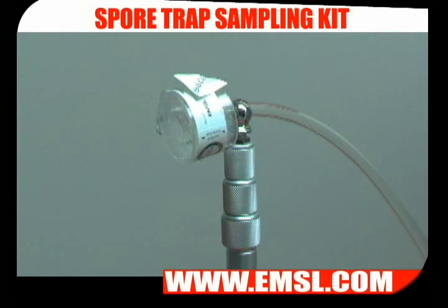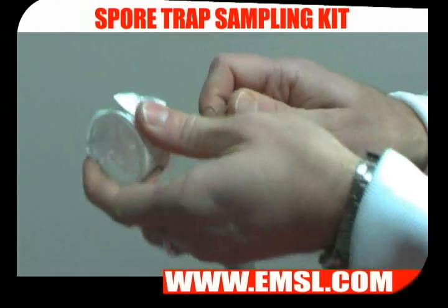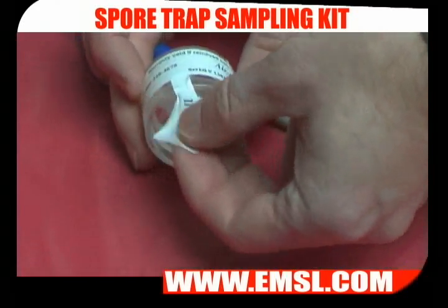Turn on your pump for 5 to 10 minutes, and once the sampling is completed, turn off the pump and remove your cassette. Finish off by replacing the sticky tabs over the openings — this will ensure that there's no cross-contamination.